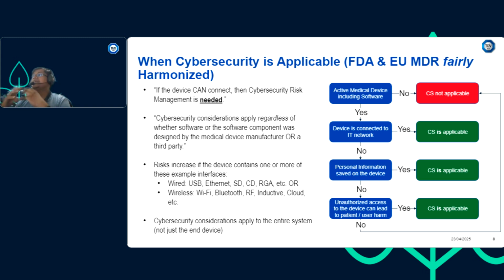Okay, now let's consider I don't have any particular device which is connected. I have a standalone device. Then I need to ask the next question, which talks about personal information. That means personal identifiable information or personal health information stored on this device.